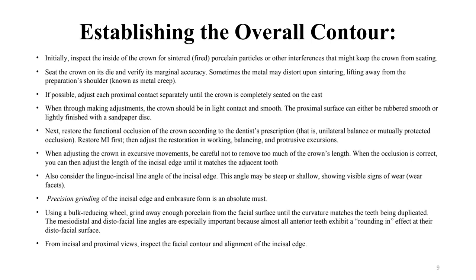So it says here, precision grinding of the incisal edge and embrasure form is an absolute must. And this is very important in terms of aesthetics when we're talking about anteriors. Why? Because we have to copy that, that's what gives us the shape, right? Remember I said if a patient has a more rounded distal, how we do that, right?